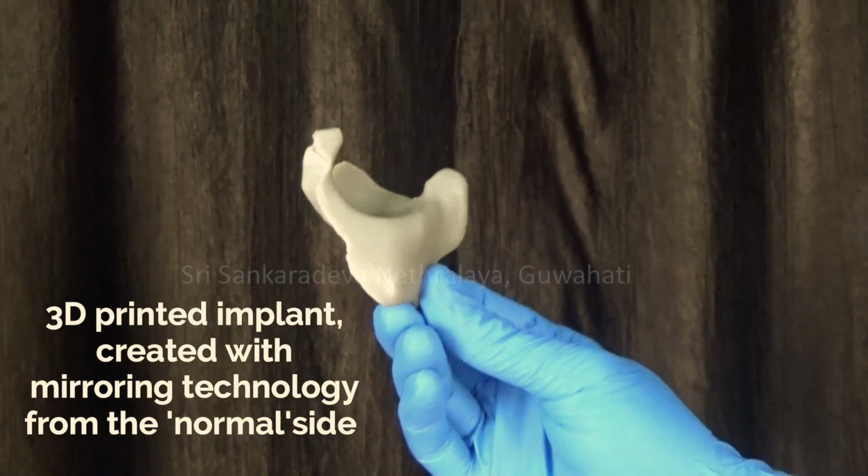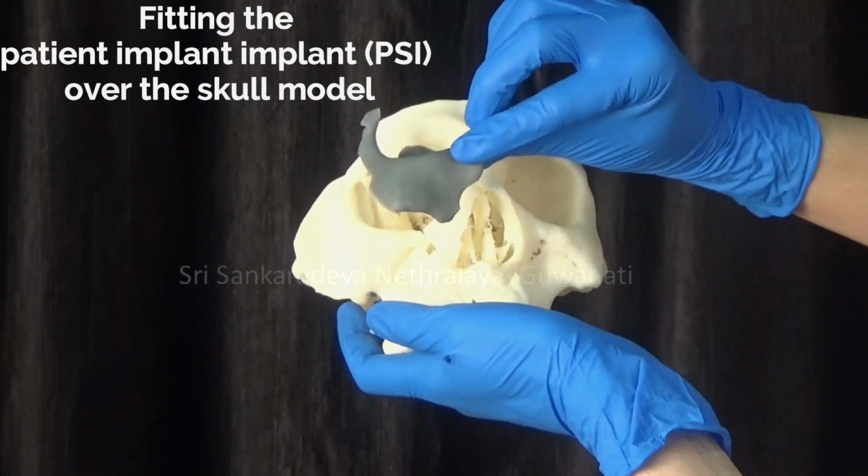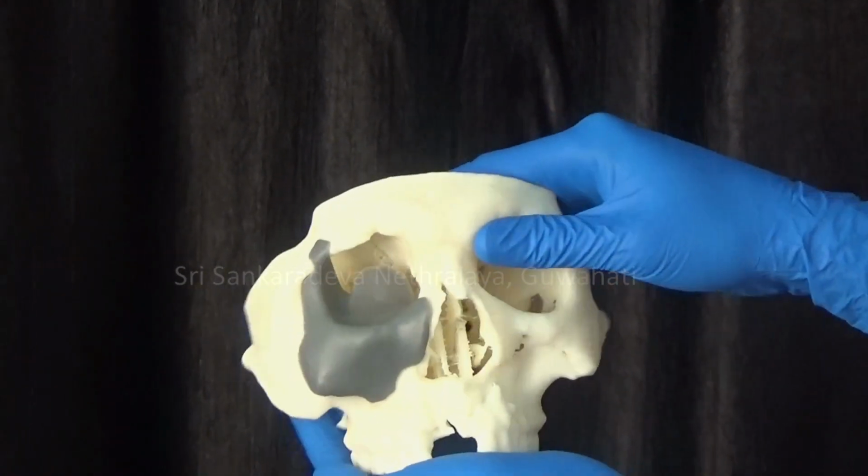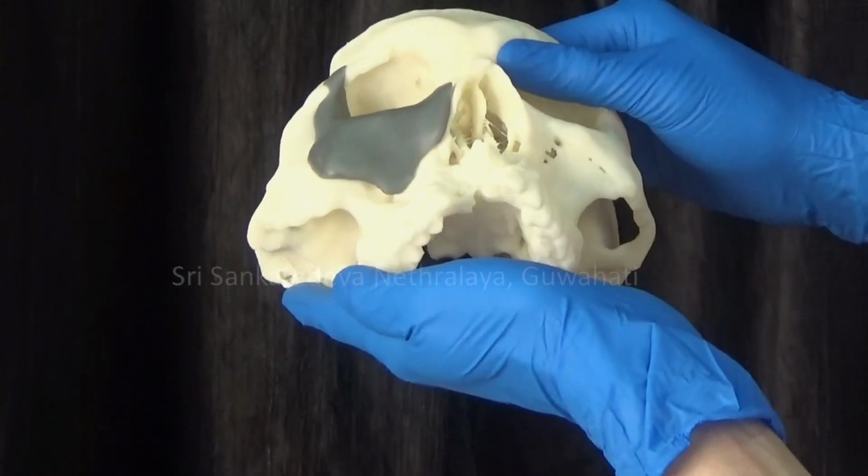So these patient-specific implants give a lock and key type fit, which gives a very precise correction and thus a very good aesthetic outcome in such complex situations.